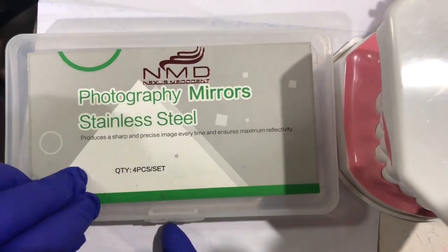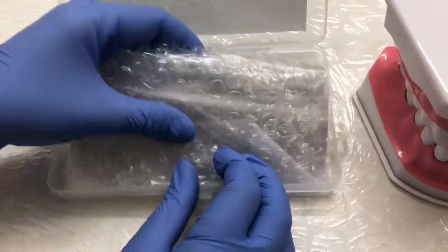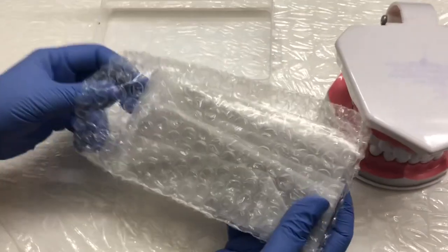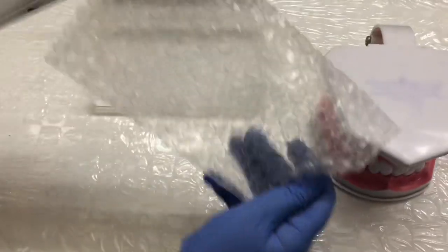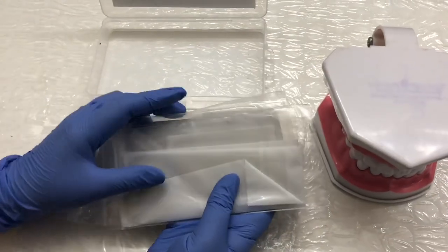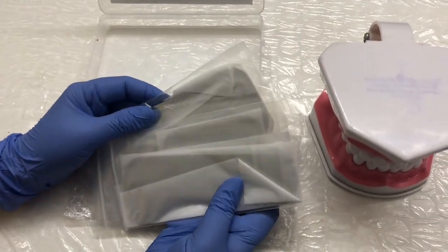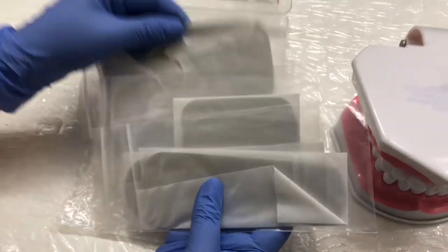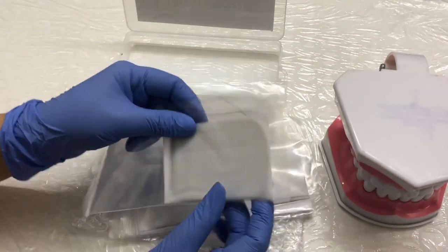Let me unbox this and show you. They have four shapes basically, and these are all light-weighted, high durability, auto-clavable, rust free, and corrosion resistant. Let me show you what the shapes are — so this is the occlusion.